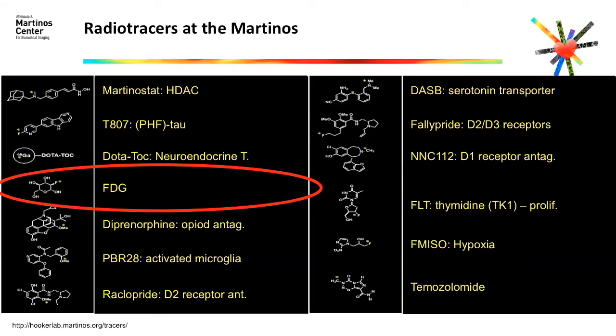The more energy a cell requires, the more it's going to use this sugar, this FDG, because this sugar is radioactive now. It will emit more from those cells that require more energy. Which cells require more energy, for instance, in the body? Well, cancer cells, for instance. Yes, they are incredibly active. They want to replicate themselves as much as they can. So they require a lot of energy.